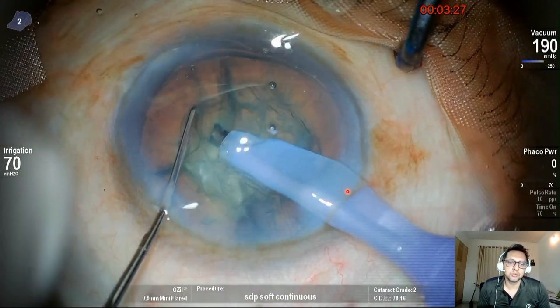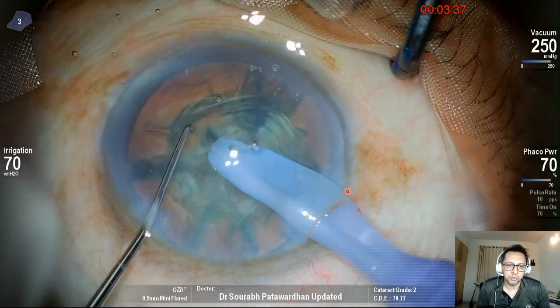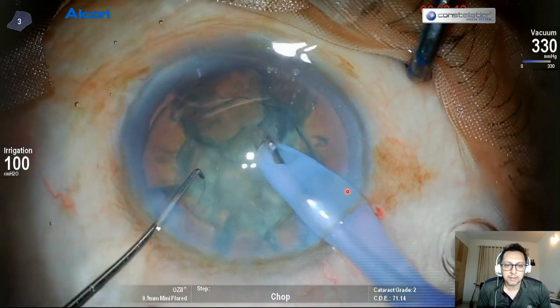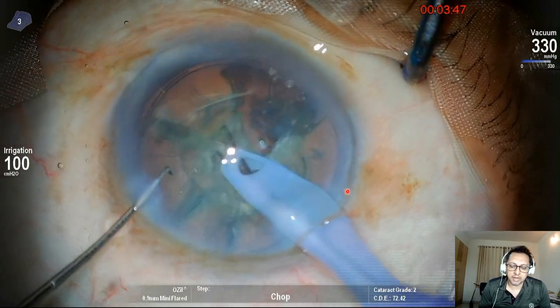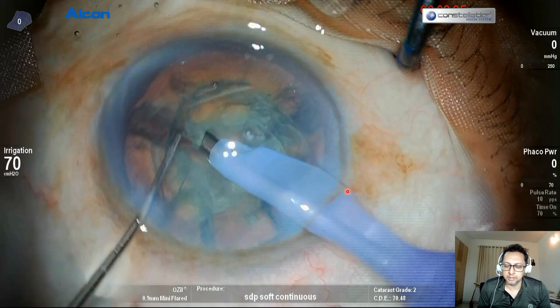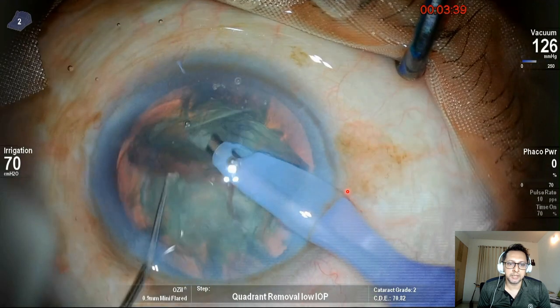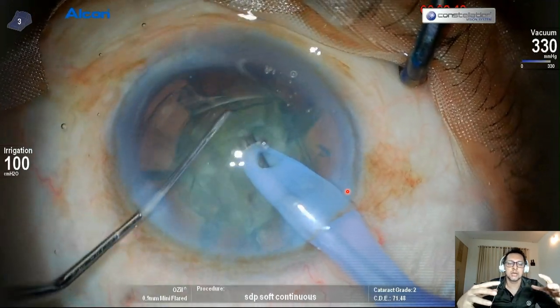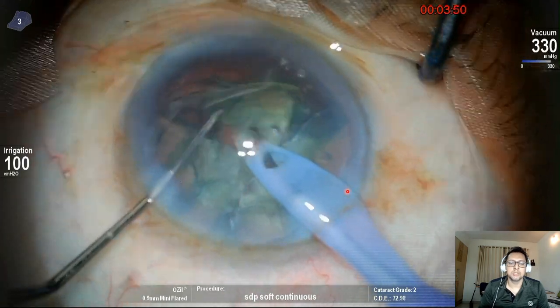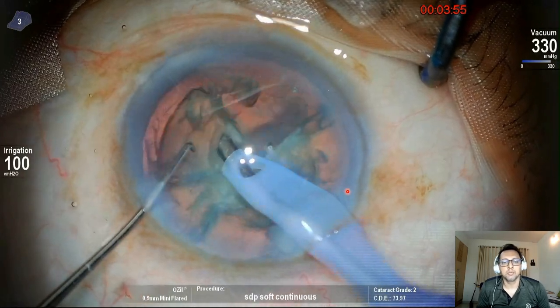This is a nice grade of cataract for beginners to test their chopping abilities — grade two cataract, which is the best. If you don't feel comfortable, you can always go back to stop and chop. Once all the pieces are made — and here I want to show you what I do when I create each piece. You can see when I create any piece, I chop it into two halves and separate it completely. If you don't have complete separation of pieces, these pieces stay stuck together. When you go to quadrant removal, using the bevel of the FACO tip sideways, it occludes these pieces very quickly, giving much quicker quadrant removal.